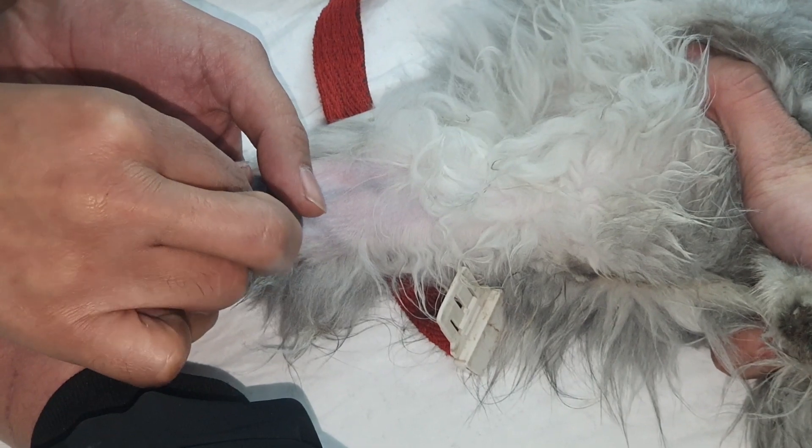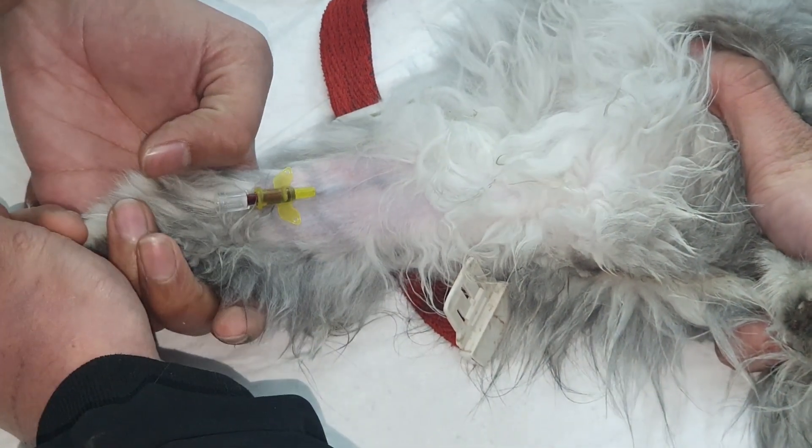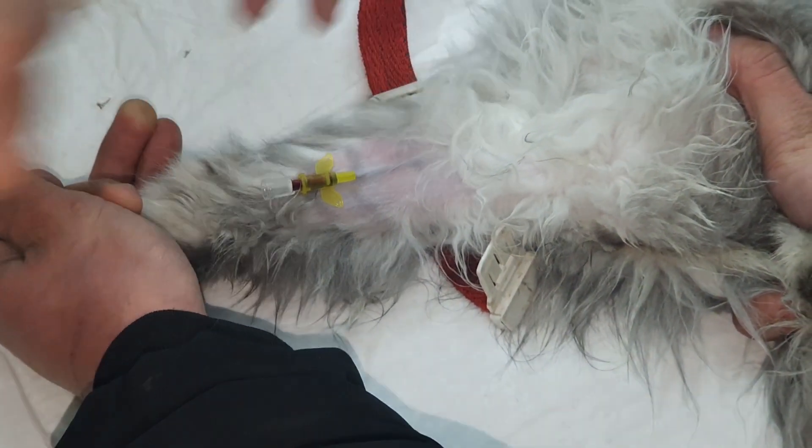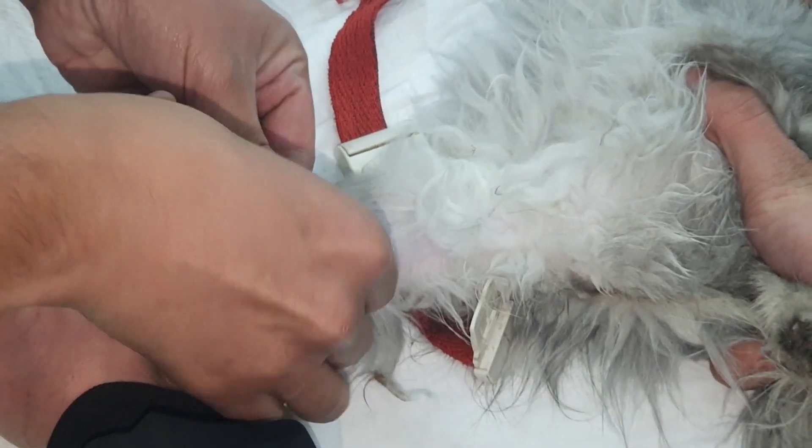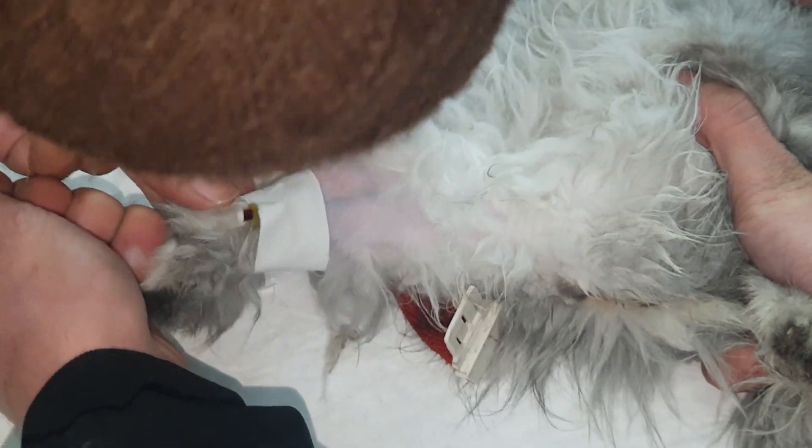We place the cap on the branula and tape the respective area so that the branula won't move and is fixed in the vein. Then we will use further drip and medication for the treatment of the cat.